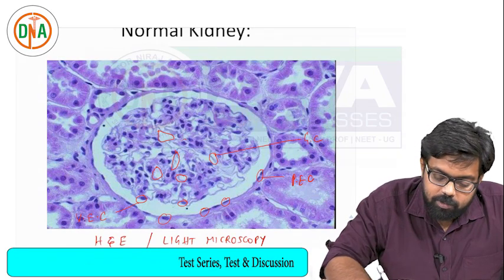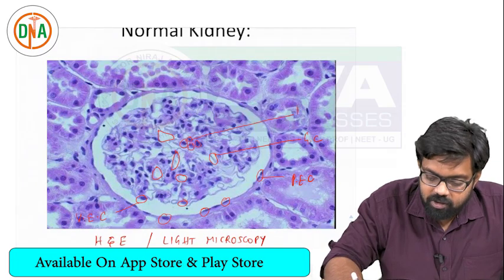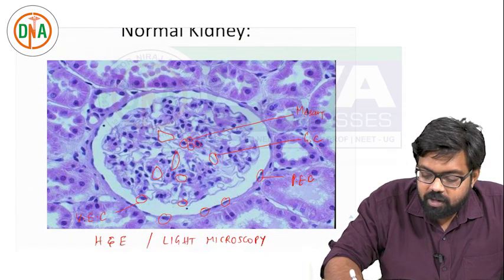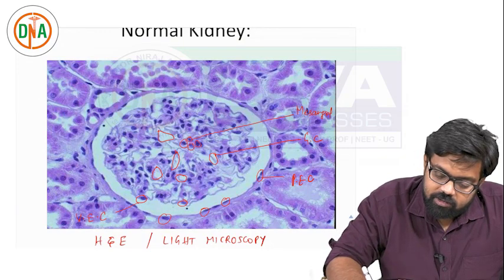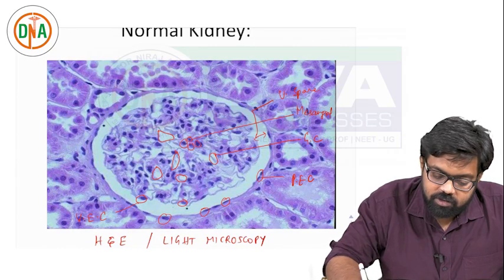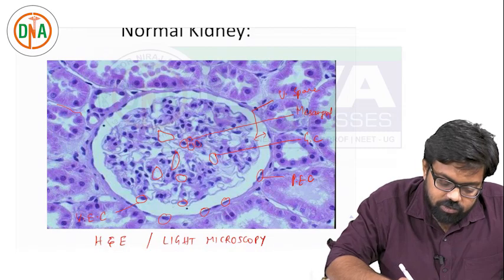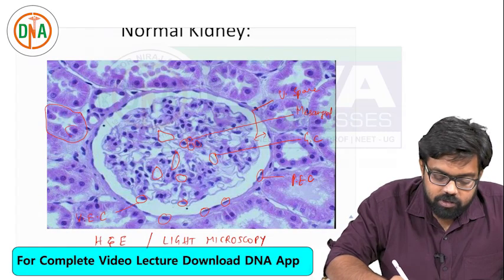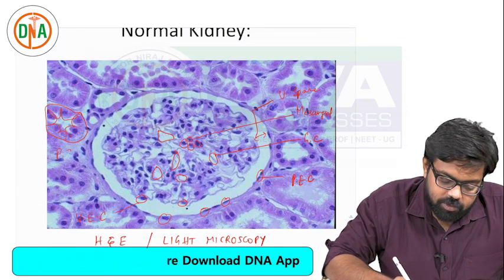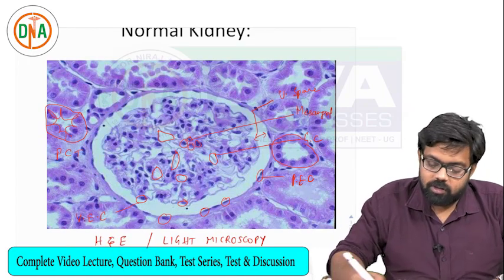In between these nuclei and these cells are nothing but the mesangial cells. This is the urinary space, very adjacent to which there are some cells with large eosinophilic cytoplasm - these are nothing but the proximal convoluted tubules.